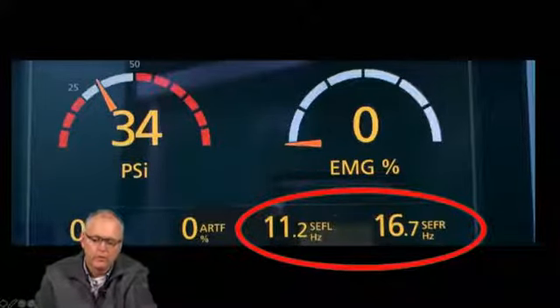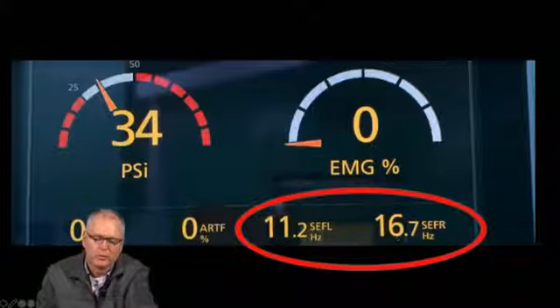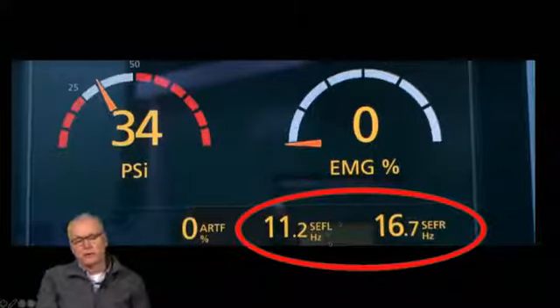What is also interesting is that these numbers tend to track what this is doing. So this is a measure that doesn't go through any black box. It's just what the brain's doing, and the changes can give you a feel for what your anesthetic is doing to the brain electrical activity.